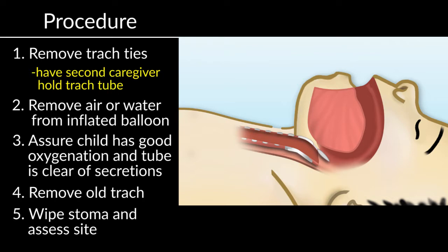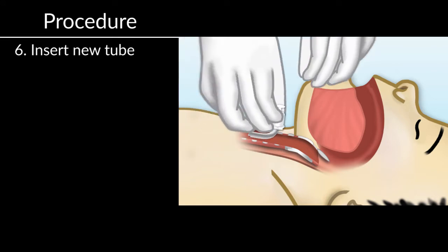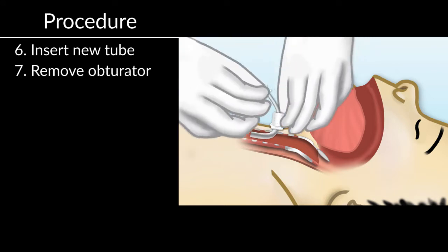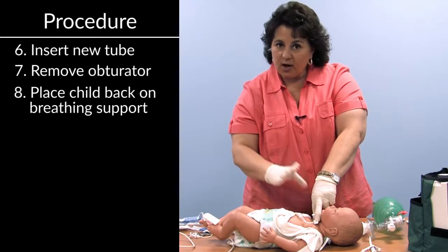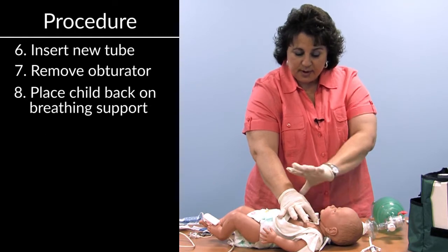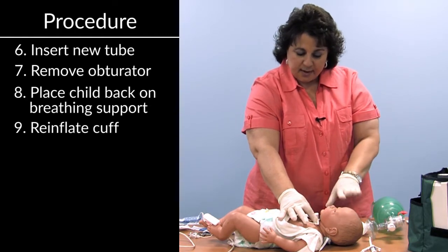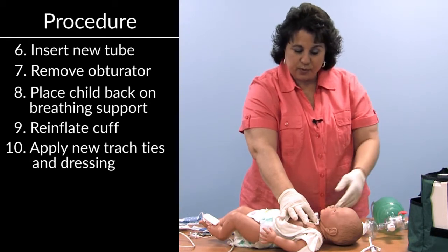We look at the stoma, we wipe the stoma, we insert the new tube. We hold the tube in, we remove the obturator, place the child back on breathing support or supply oxygen. If they're not on either one, that's fine. Just let them breathe through the tube, settle out for a moment, and then we will deal with putting on the new ties and the new dressing.